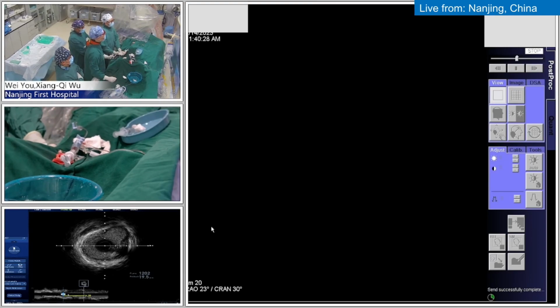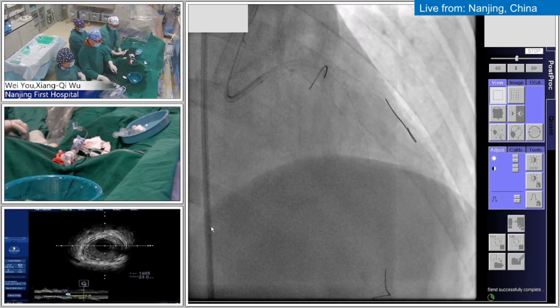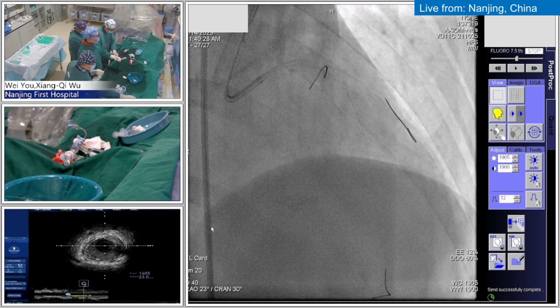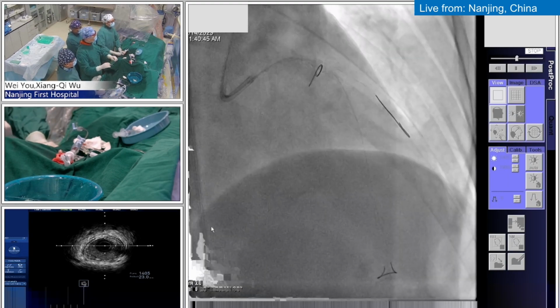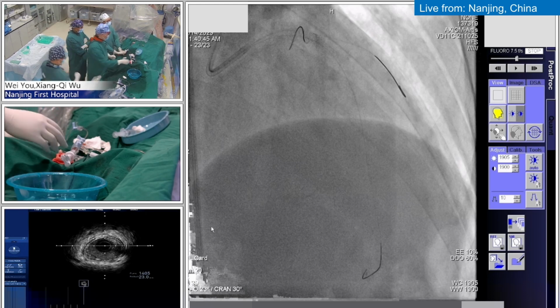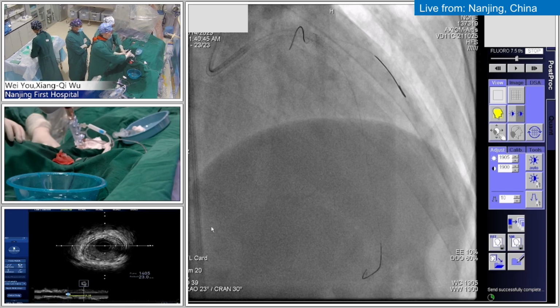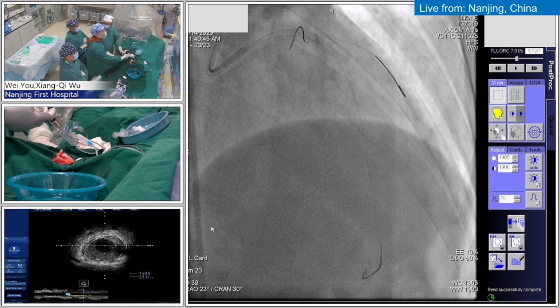Lack of calcification in a bifurcation lesion is, I think, the single biggest factor which makes it easier to expand the stent and have long-term better outcomes. Are there any first-in-man devices you have used at your hospital? First in man, maybe Chinese domestic. What about some techniques like pulmonary artery denervation? Yeah, that has been pioneered here, right?